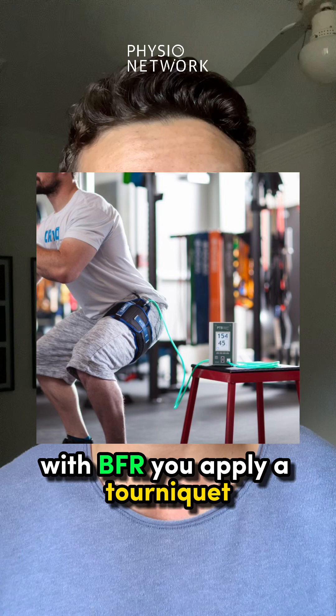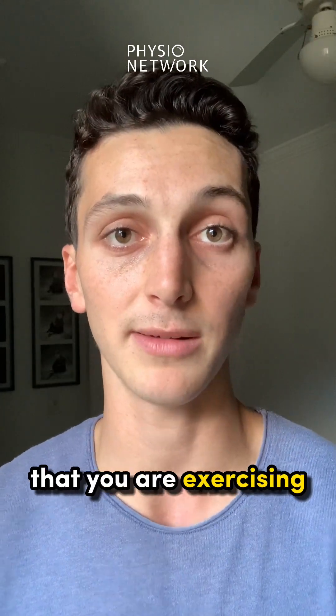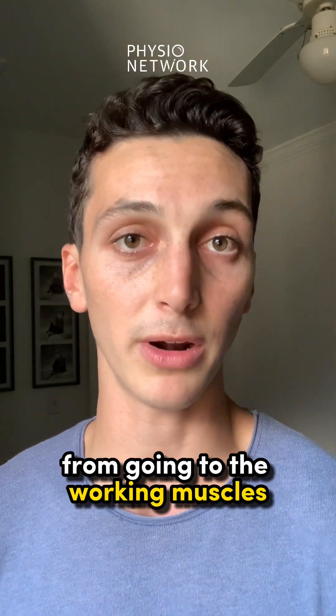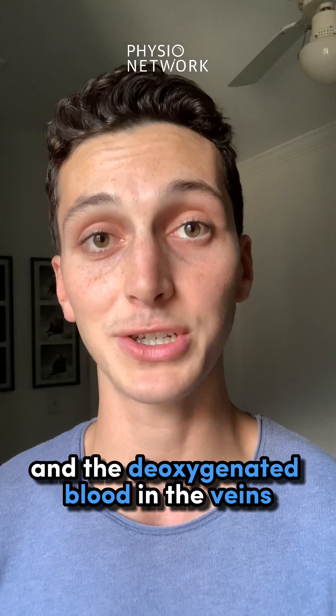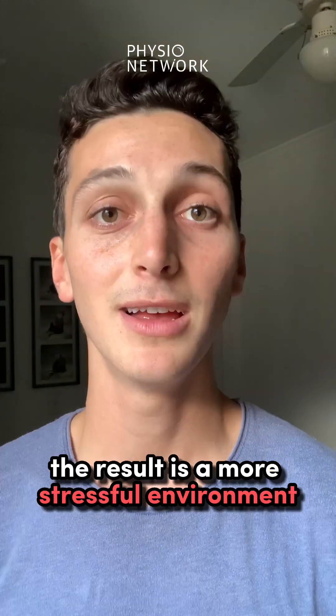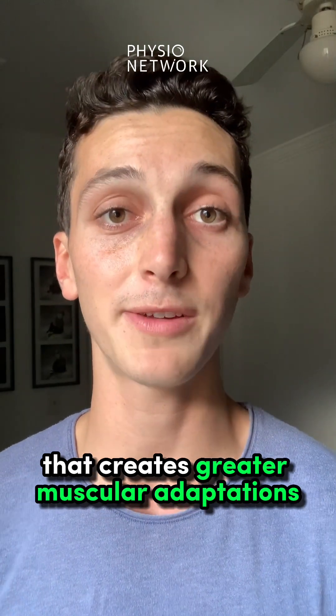With BFR, you apply a tourniquet or a blood pressure cuff to the limb that you are exercising. The oxygenated blood in the arteries will be partially stopped from going to the working muscles, and the deoxygenated blood in the veins will be completely stopped from going back to the heart. The result is a more stressful environment that creates greater muscular adaptations.